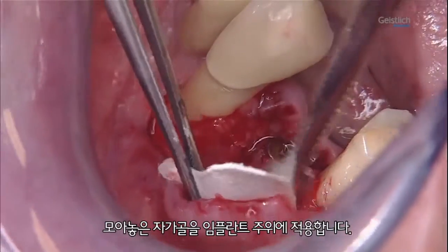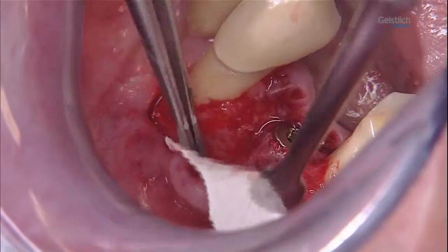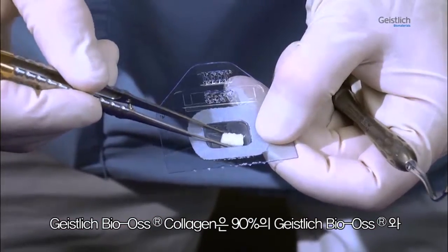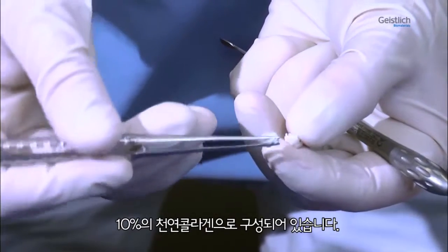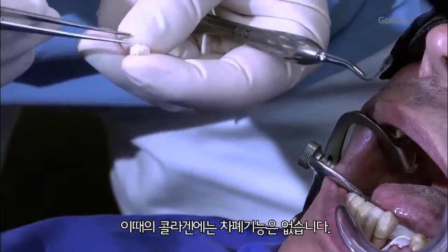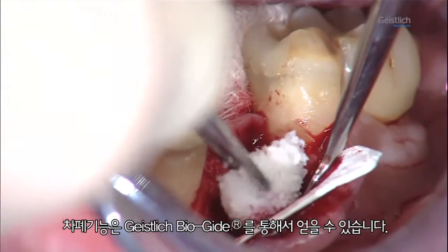The collected autologous bone is applied in close proximity to the implant. The Geistlich Bio-Oss collagen block consists of 90% Geistlich Bio-Oss granules. The remaining 10% is collagen, which holds the Geistlich Bio-Oss granules in the block together. This collagen has no barrier function. The barrier function is provided by the Geistlich Bio-Gide membrane.